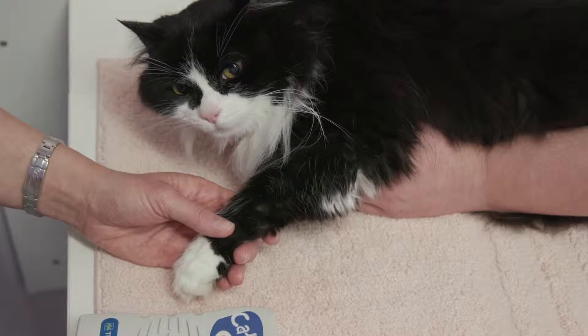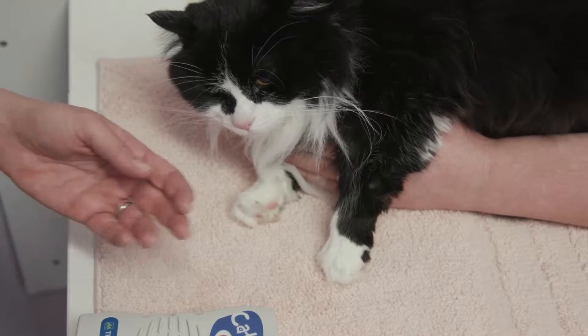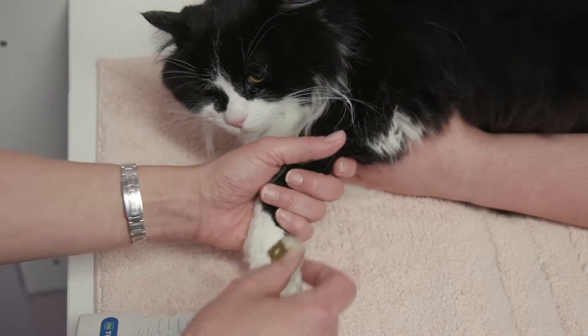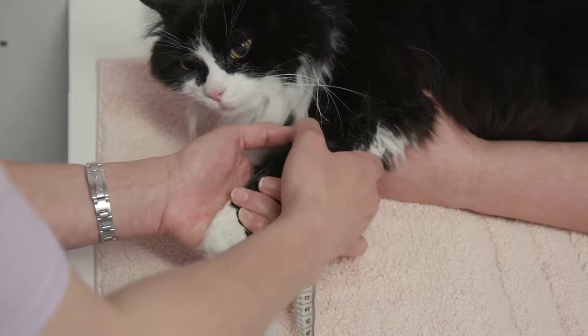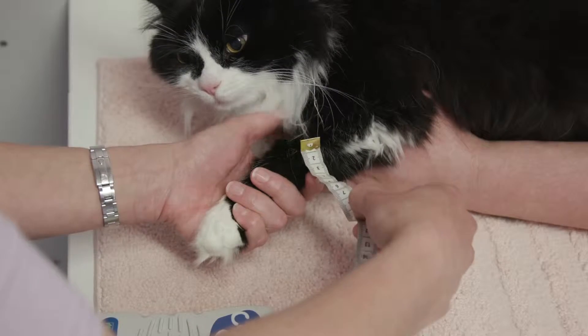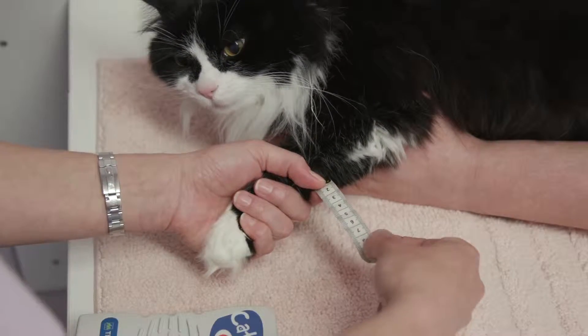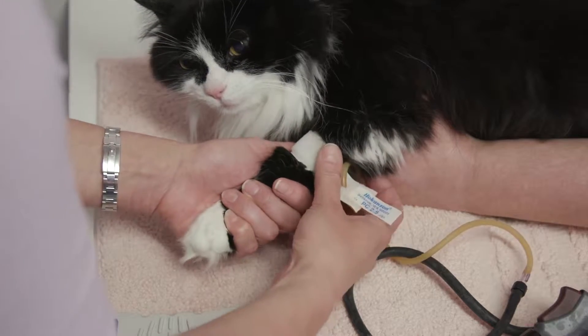We want to place a cuff on the forelimb or on the tail. These clips will show placement on a front leg, and the cuff width should be between 30 and 40% of the limb circumference. So it's useful to measure the cat's limb to make sure that the cuff you are using has an appropriate width. The cuff should fit comfortably but not be painful.